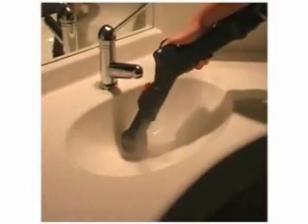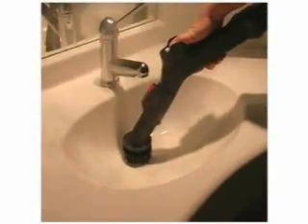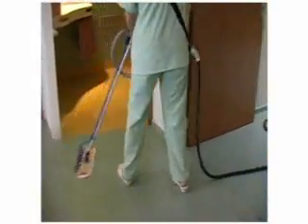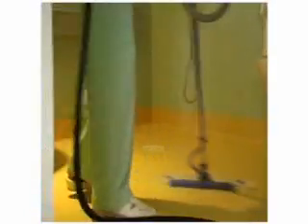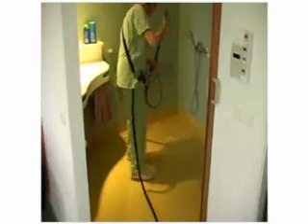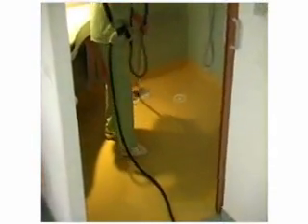Washrooms and sanitary appliances are minutely cleaned according to stringent procedures. The floor may be cleaned in two different ways. The first method is to proceed as explained earlier with a steam brush. The operation is thus identical to that carried out in the daily cleaning of a patient's room.